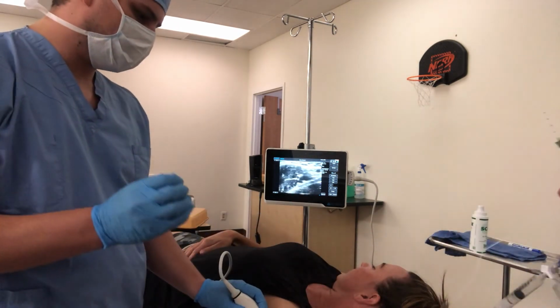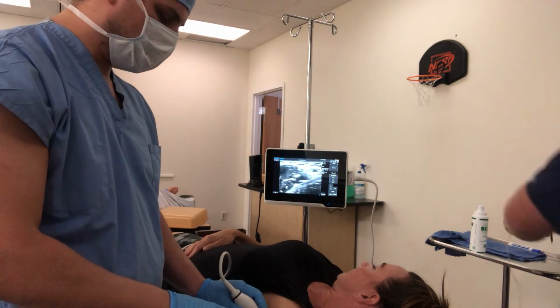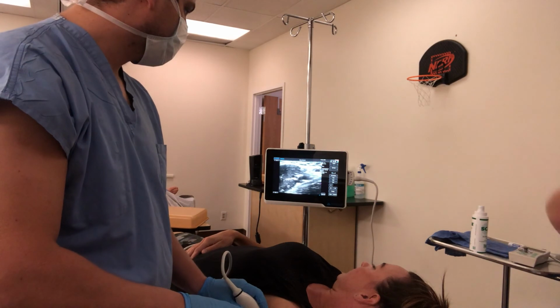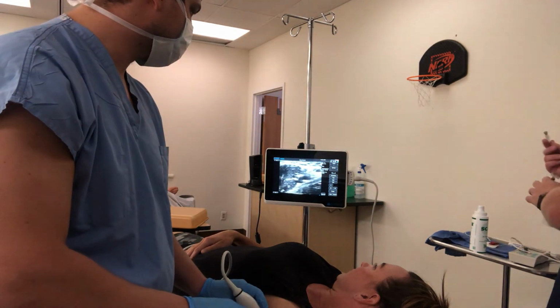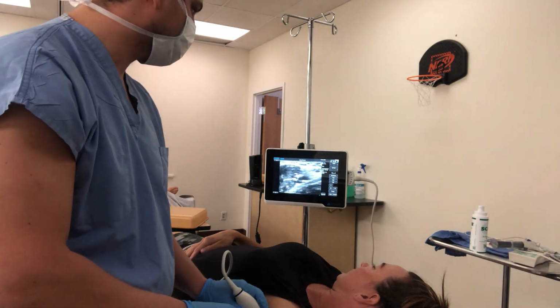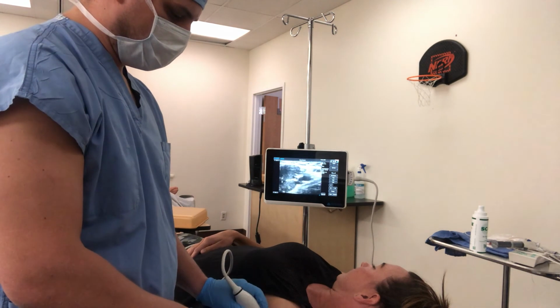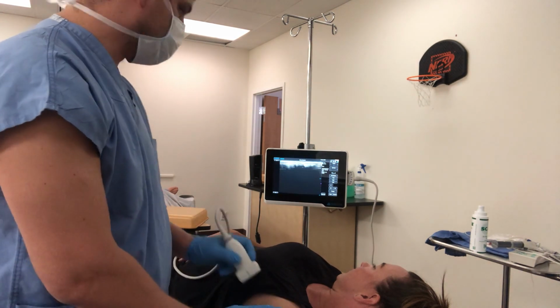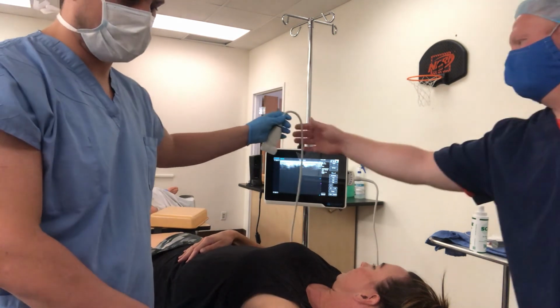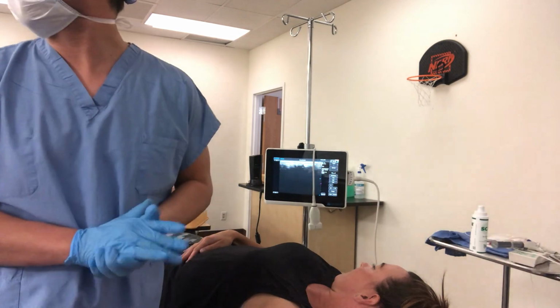After I have injected the local anesthetic and ensured that I picked off the radial, ulnar, median, and then musculocutaneous nerve using about 6 to 7 milliliters per nerve, no more than about 20 to 25 milliliters, I will then place a dressing on, make sure there's no bleeding, and ensure that I have good effect of the local anesthetic.